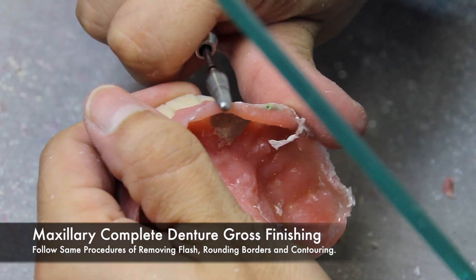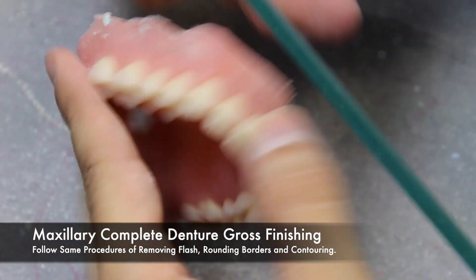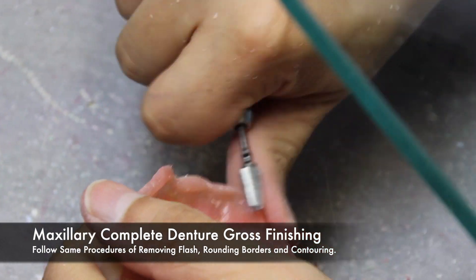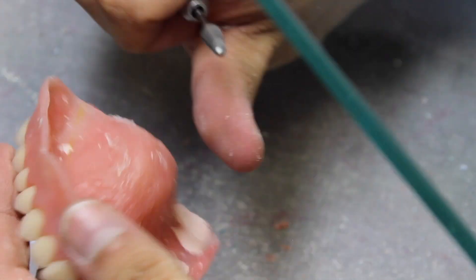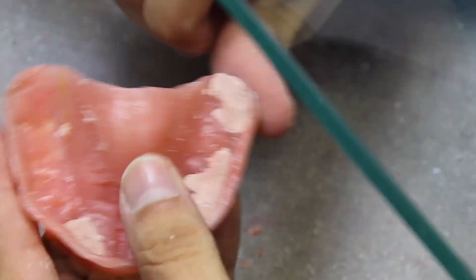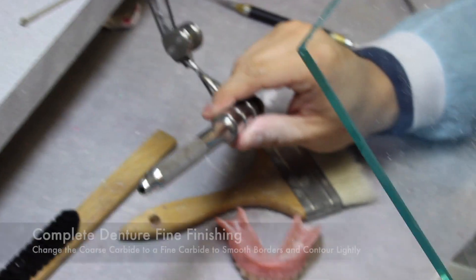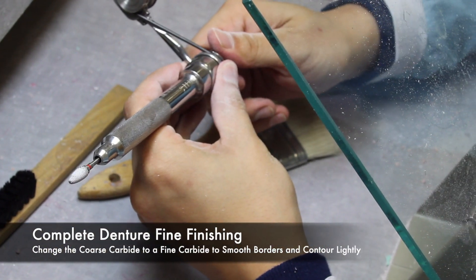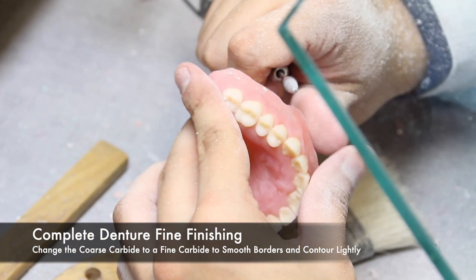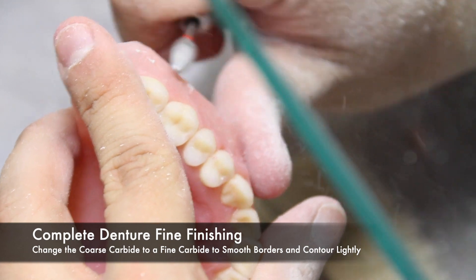You can follow the same procedures of removing flash, rounding borders, and contouring, just as you saw on the mandibular denture. When the coarse reductions are complete, it is time to put a fine finish on the dentures. Switch out the burr to a fine carbide, and you can begin to smooth the borders and contour lightly.